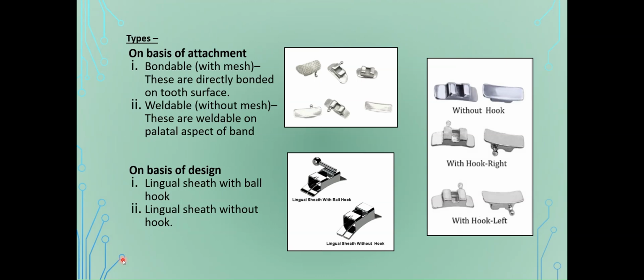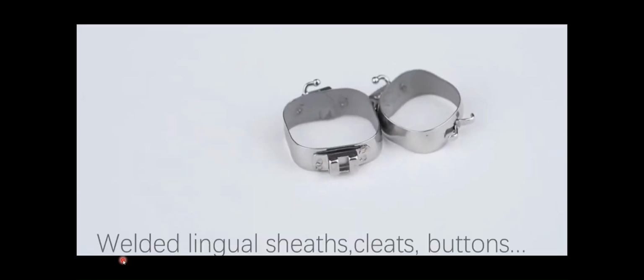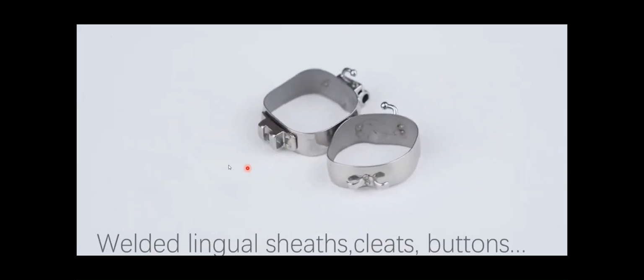Here are the types. On the basis of attachment: bondable, which are directly bonded to the tooth surface, and weldable, which are welded on the palatal aspect of the band. On the basis of design: lingual sheath with ball hook and lingual sheath without hook. This video shows a lingual sheath that is welded to the band.